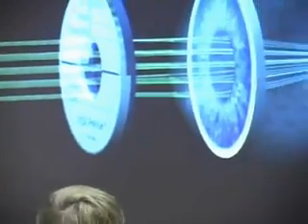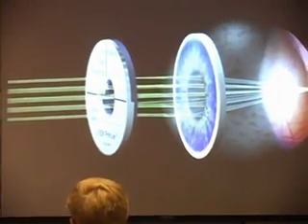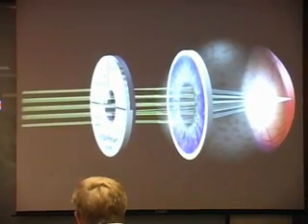One of the things we could do is, we had the model that described how the laser interacted with the cornea. We were able to replace that with a model that described how the laser interacts with optical grade plastic. And so you could take a patient whose vision was something like this, and we could take a lens, and we could calculate what was the wavefront we would have to do to pre-warp the light so that by the time it got to their eye, it would neutralize the aberrations that they already had. And so that was one of the safety things we were able to do. Try this for each patient, give them a lens, have them put it on, look at an eye chart, and see, were they happy?